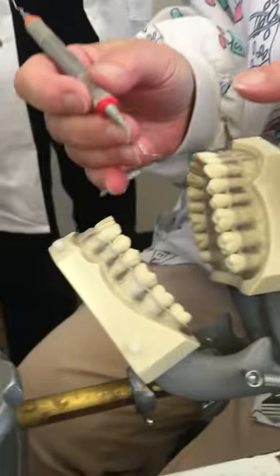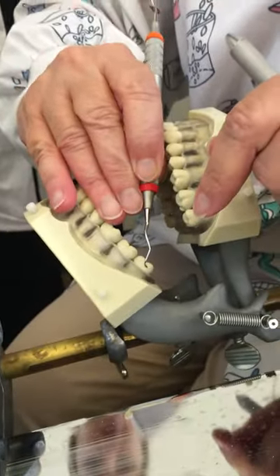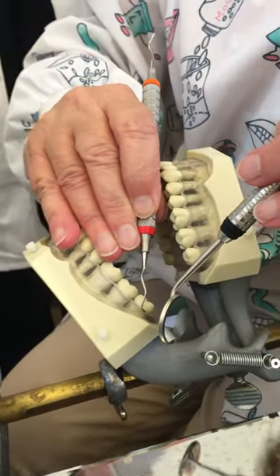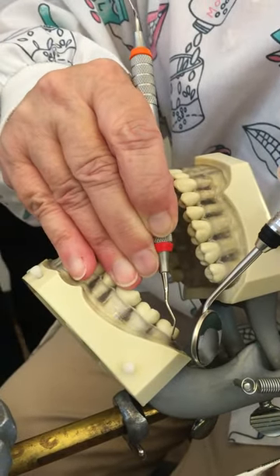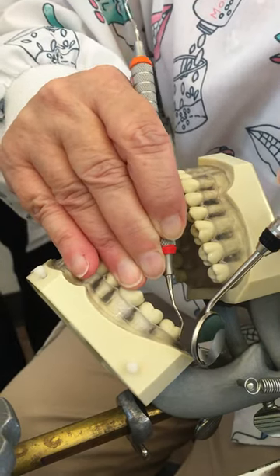And when it's wrong, it's really wrong. So now I'm coming in through the arch. I'd be retracting the cheek. I'm going to go enclosed — pulling close to the tooth — and then open slightly, keeping my terminal third of the blade or cutting edge on the tooth.